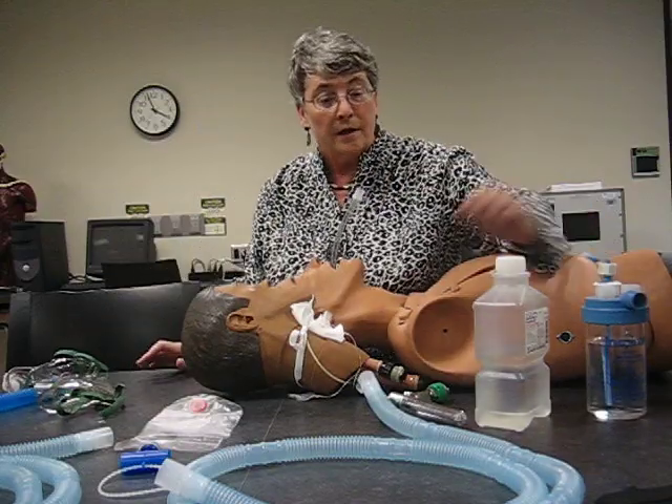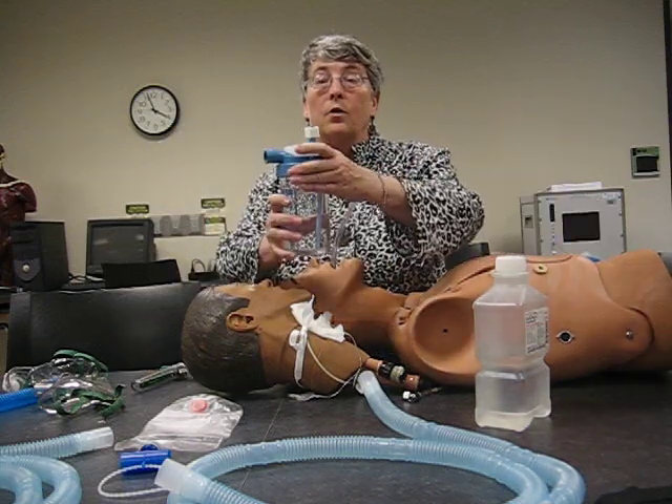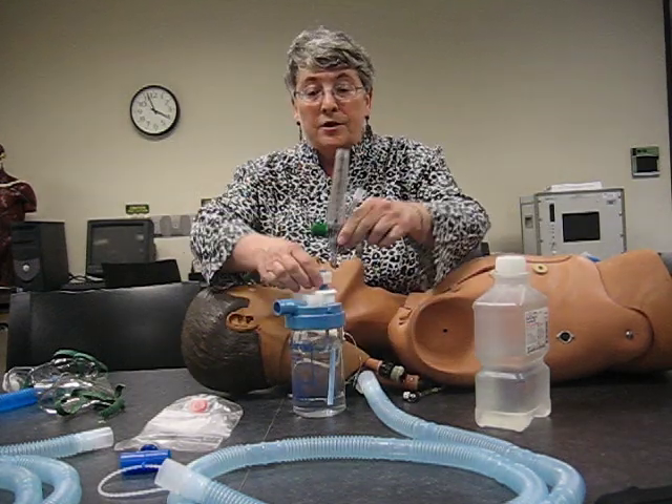All these devices have one thing in common: they have an oxygen source that goes to a jet nebulizer, or large volume aerosol generator. I've set the FiO2 at 40% and will attach it to my flow meter.